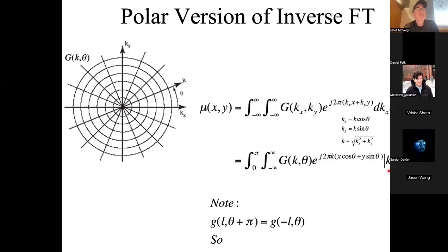Does that mean like the k is always the same? Like, I guess it's just like in the polar coordinates, is it always a round circle? Yes. Yes. So we're going to do polar coordinates where we just have a circularly symmetric sampling of this thing. Yep.